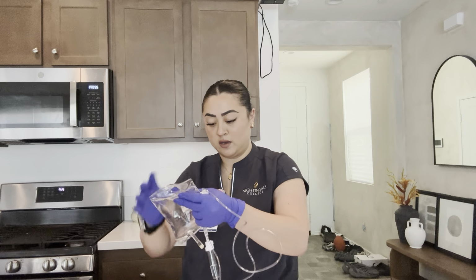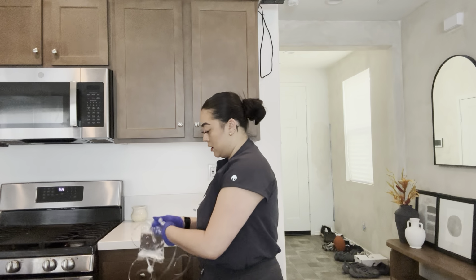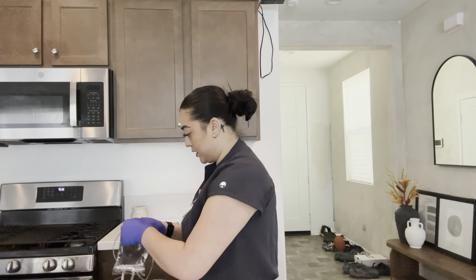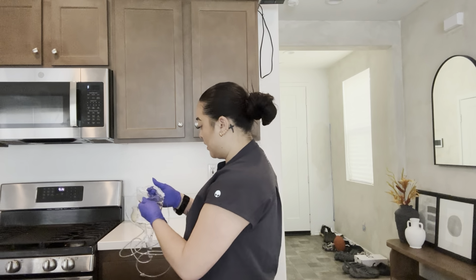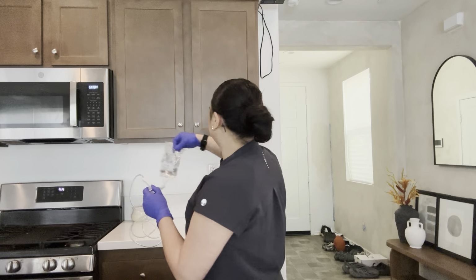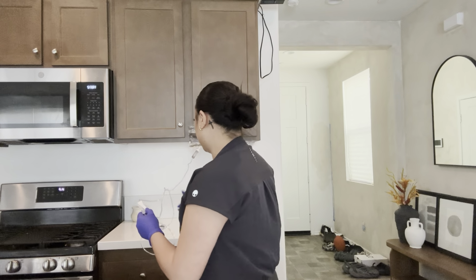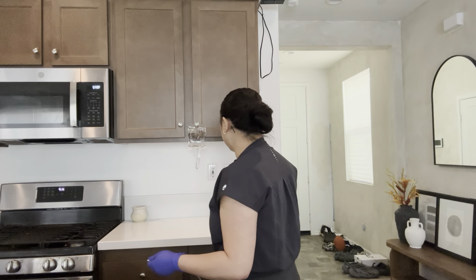And I am going to prime this because we don't want any air being injected into the patient. So I'm going to go ahead and just get the cap off there. We want to make sure that we hang this about 30 inches above the patient. So I'm just going to put that right there. I don't have an IV pole. And I'm just going to get ready to prime here.